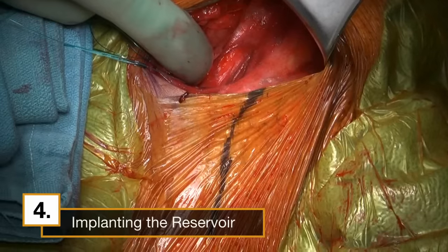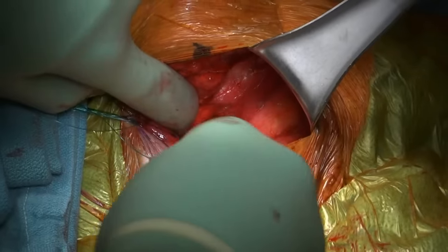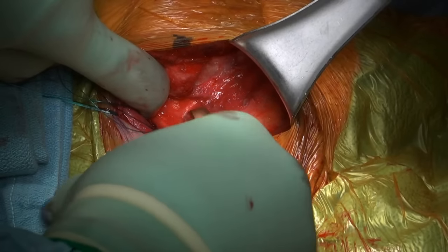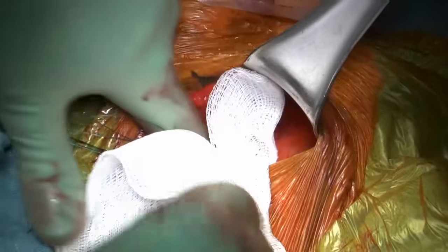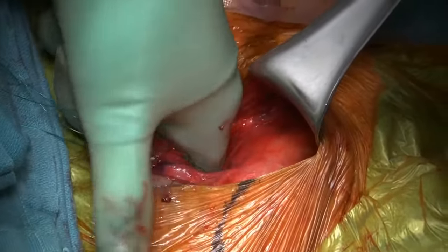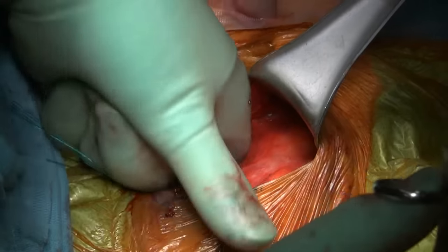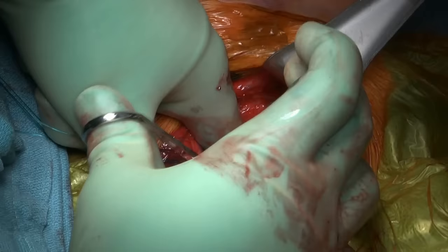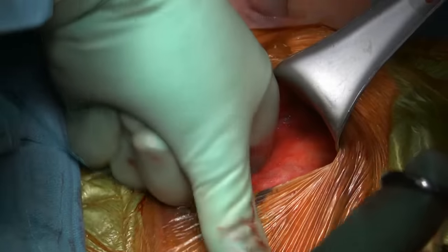I gently open the thin layer of fascia to prevent the external fat from occluding entry into the external inguinal ring. Now we can see the clean, glistening fat that overlies the external ring. I enter the pre-vesicle space in a very controlled fashion. I use the external ring and the posterior aspect of the pubic symphysis as my key landmarks. Our goal is to perforate through the transversalis fascia. I gently perforate the fascia with my METS by pushing medially against the symphysis. I then do limited blunt finger dissection to assure that we are in the correct space.